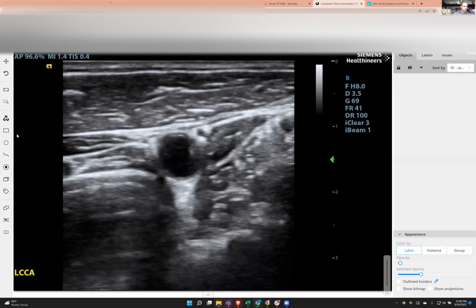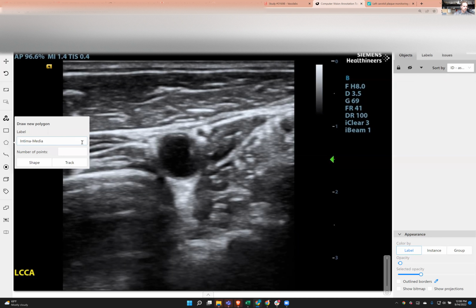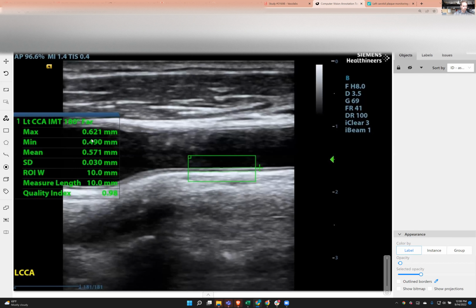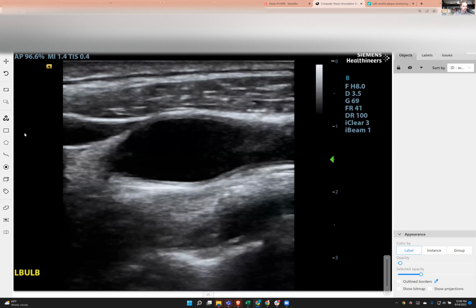As the ultrasound software and equipment got better, I made my service better. And when the pandemic hit, I had to upgrade everything. And so I spent a lot of time and resources playing with the boxes, the ultrasound machines, talking to reps, finding out what software was out there.